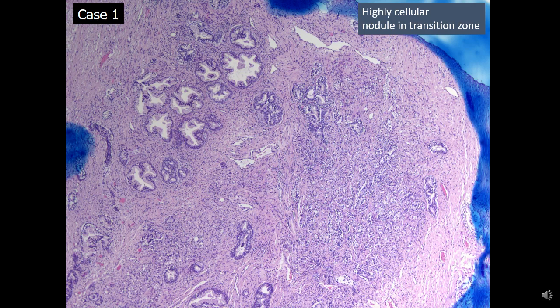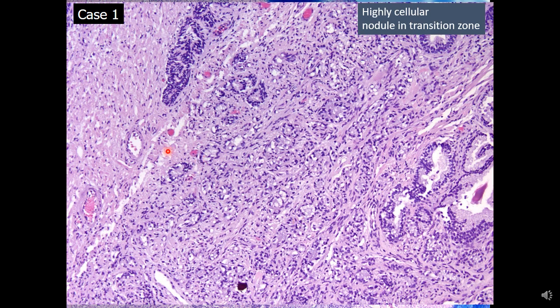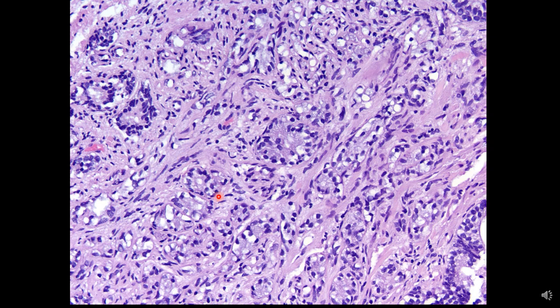These nodules appear to be relatively circumscribed — that's an important feature to bring up. At closer examination you can see the sharp circumscription of these very cellular nodules. At high magnification this nodule is made up of some well-formed glands, numerous poorly formed glands, single cells, cells that appear to have signet ring cell type appearance, and also a very cellular spindly stroma.